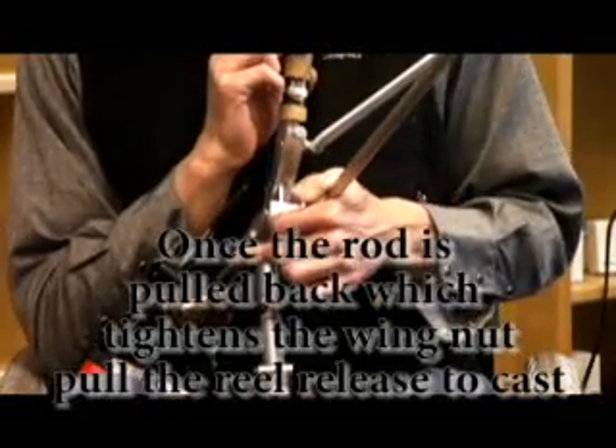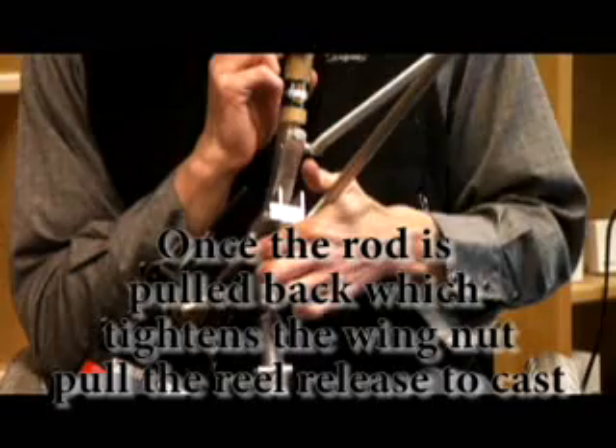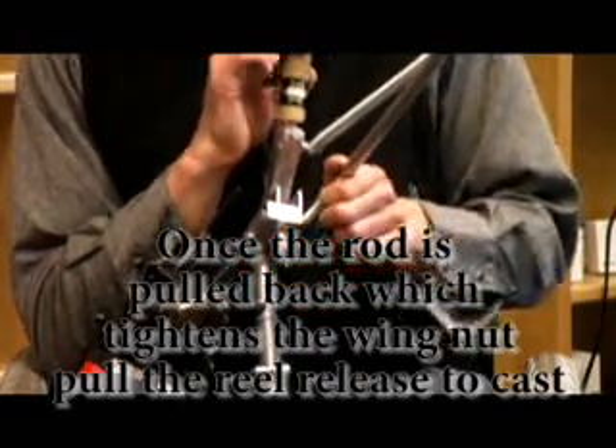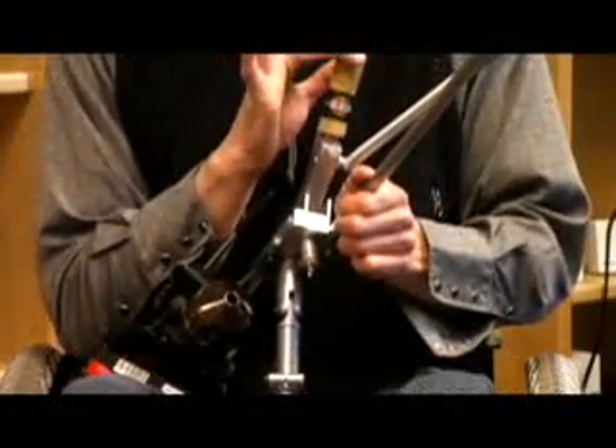After the rod is pulled back, you release the trigger for the line, and then let the rod go, and it will cast.